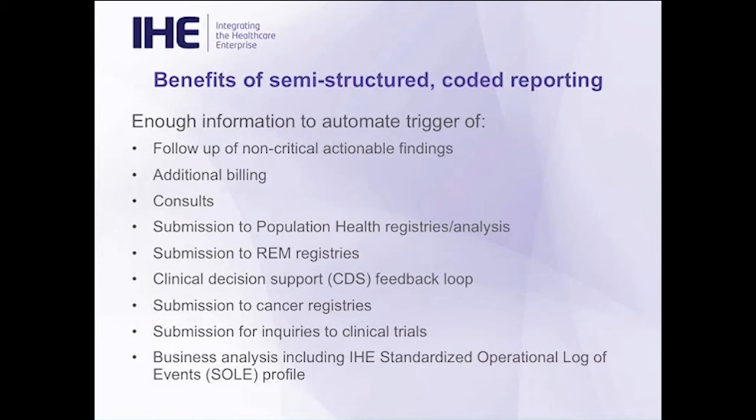Additional information that's available in the structured, semi-structured coded report is billing, the ability to automate or at least to question whether or not a consult is needed, submission to different types of registries, clinical decision support feedback, potentially identifying studies for clinical trials, and then including information in the IHE Standardized Operation Log of Events, or SOLE, profile, which is another webinar that you might want to take a peek at.